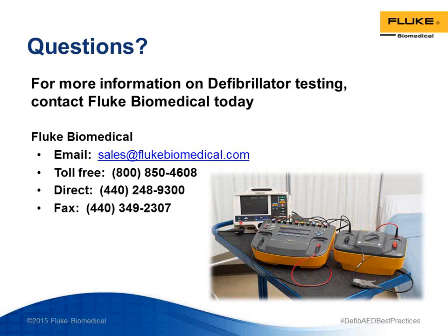Excellent. Okay, here's another question for you guys. Can the test load shown in the picture be used along with an Impulse 7000 during test? I'm sorry, state the question again, please. Certainly. Can the test load shown in the pictures be used along with an Impulse 7000 during test? Indeed, yes. In fact, it can't be used by itself. We're talking about the 7010 external load accessory, and it needs to be used with the Impulse 7000 every time. It simply replaces the 50 ohm load that's built into the Impulse 7000 with the selectable loads in the box.